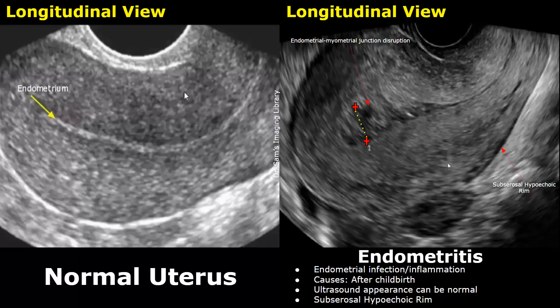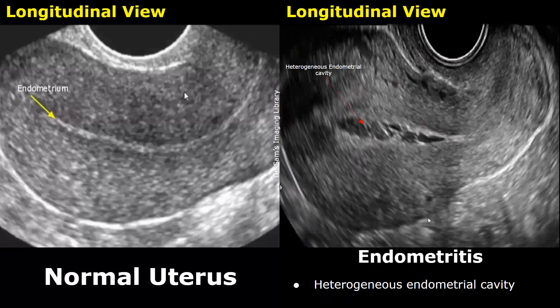The next feature usually associated with endometritis is a subserosal hypoechoic rim. You can see a dark hypoechoic border around the uterus. Normally we see a bright hyperechoic border around the uterus. The hypoechoic rim represents fluid due to inflammation. A subserosal fibroid is also present in this image. A heterogeneous endometrial cavity is usually seen in endometritis; however, this feature needs to be correlated clinically.